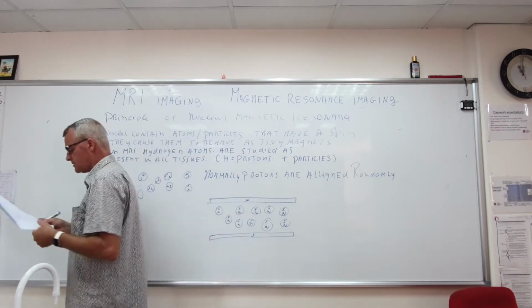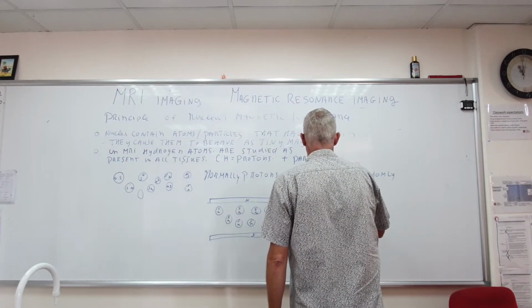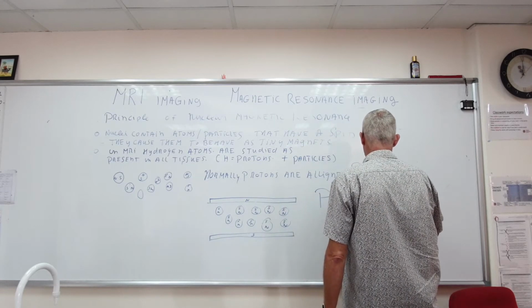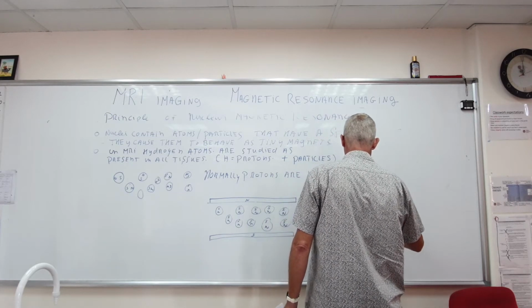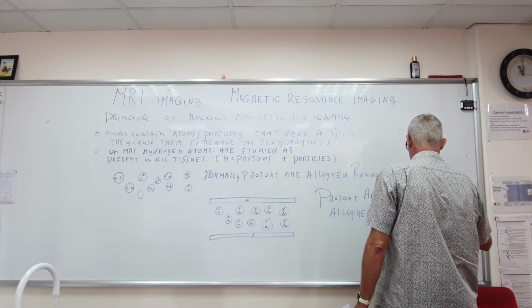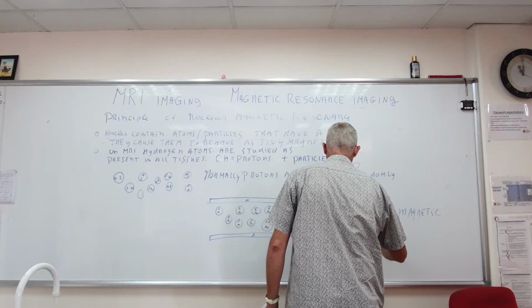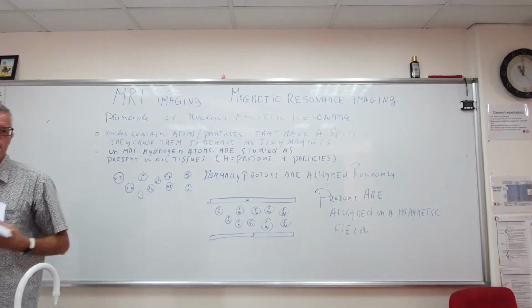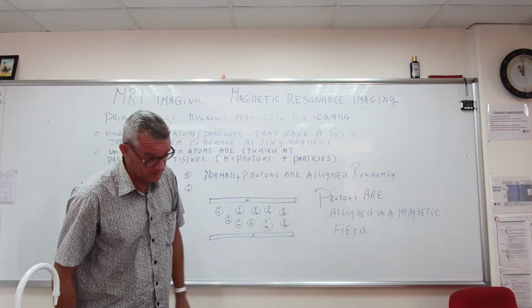Okay? So, we say protons are aligned in a magnetic field.